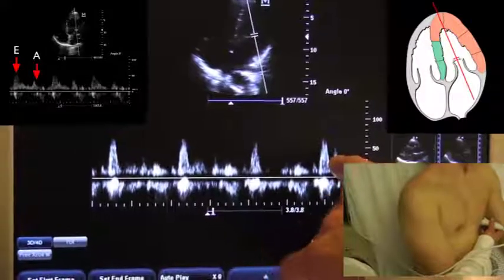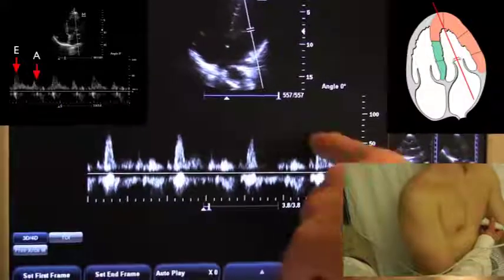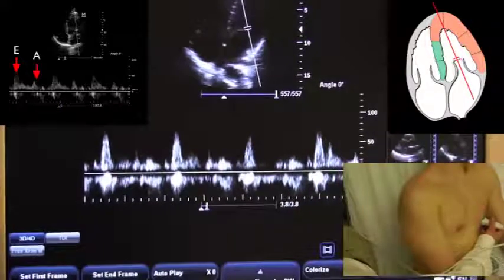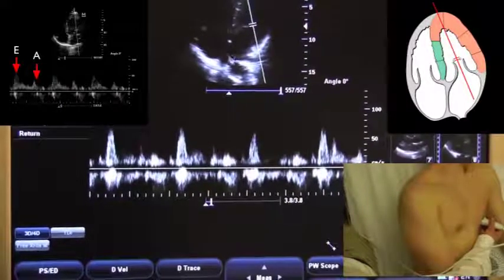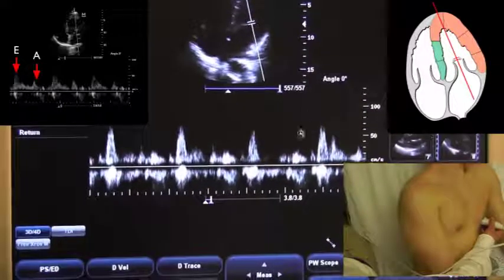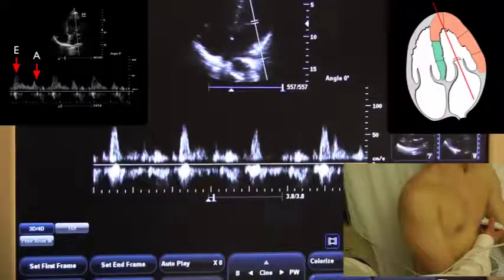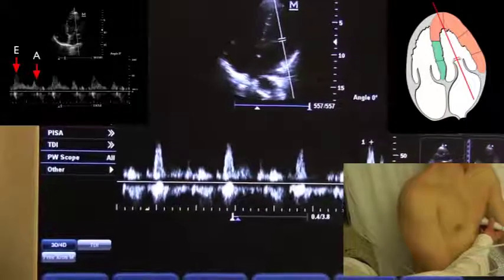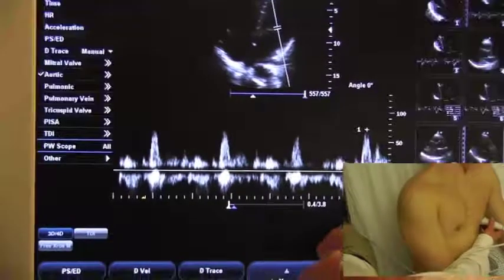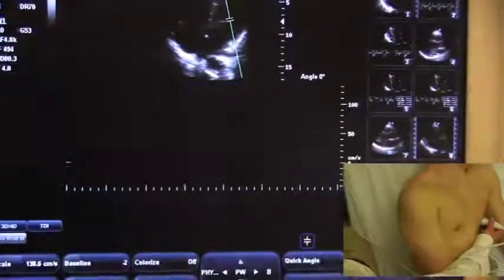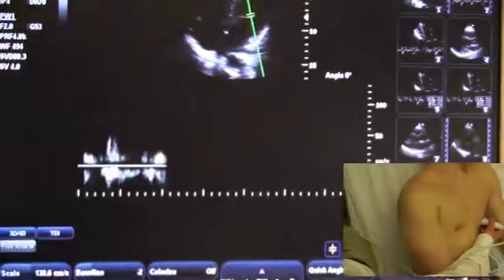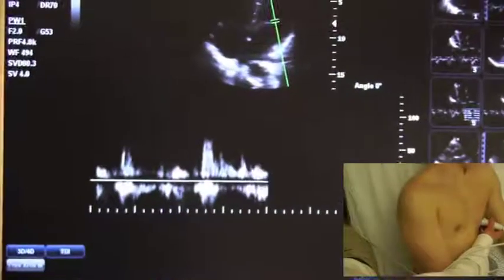This will give me an E and an A wave for each diastolic filling period. E corresponds to early filling, and A corresponds to the atrial contraction. Typically, the E should be twice the size of the A. I can measure the E wave, and I would expect it to be less than 100 cm per second. This is a normal filling pattern.